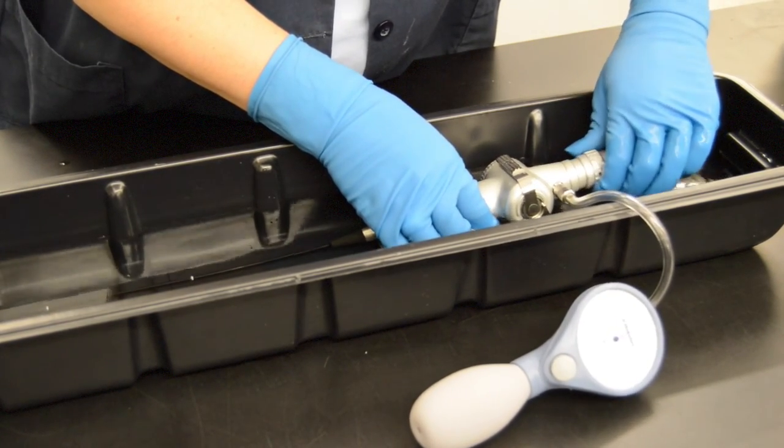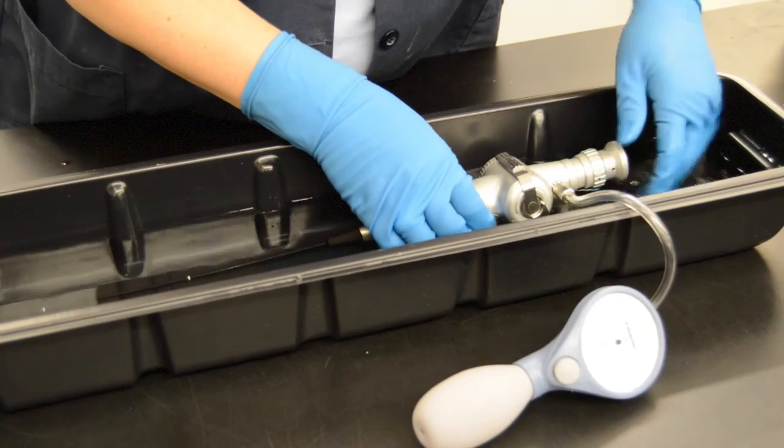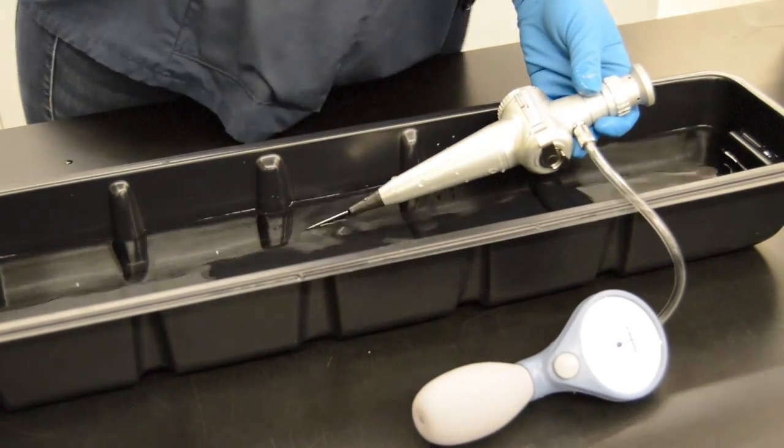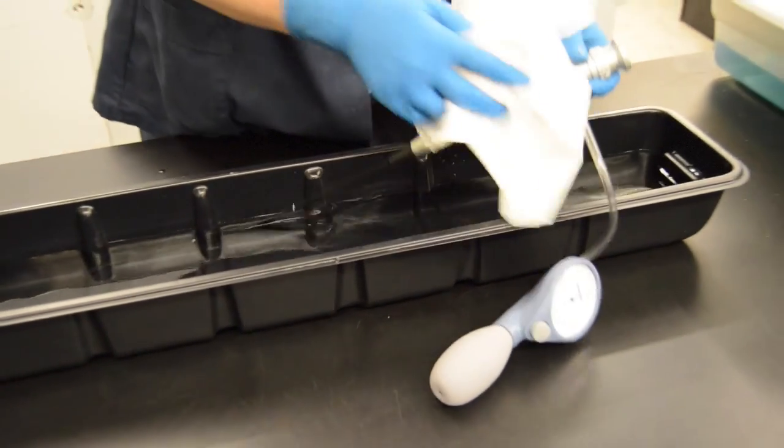Absence of a steady stream of air bubbles confirms that the endoscope is watertight. Remove the endoscope from the water and disconnect the leak tester from the endoscope.